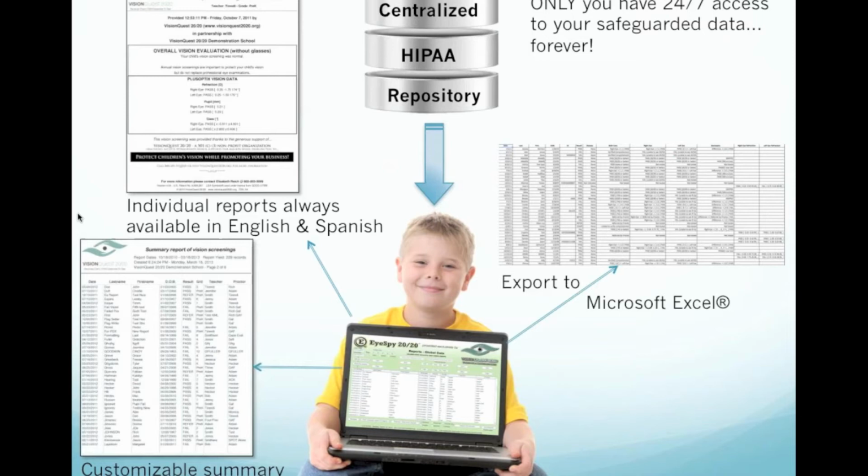And at that point, it's no longer HIPAA compliant because we don't have control over the data. If you lost that data, so to speak, it's still in the centralized repository, but the security breach of losing that Excel spreadsheet is no longer within our control, obviously.